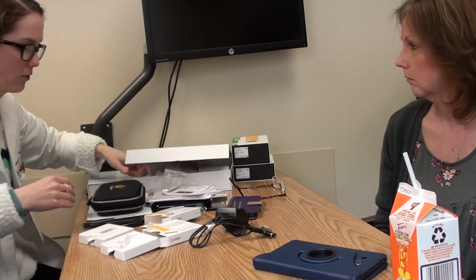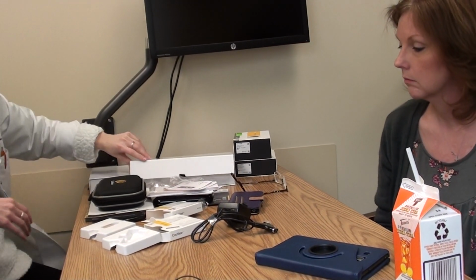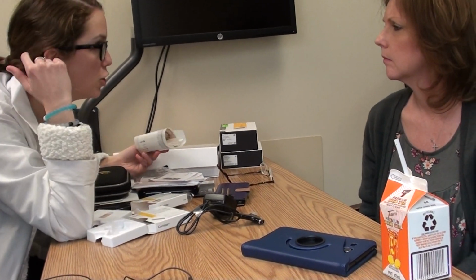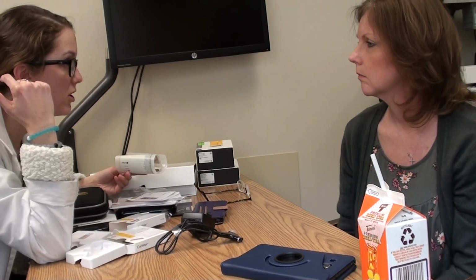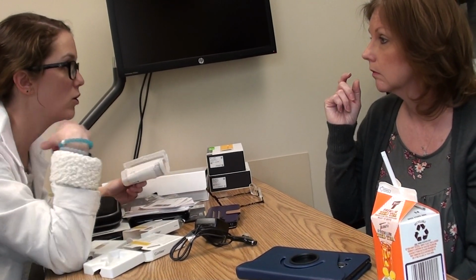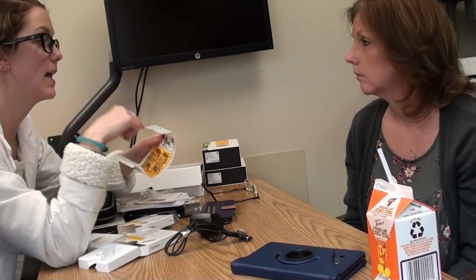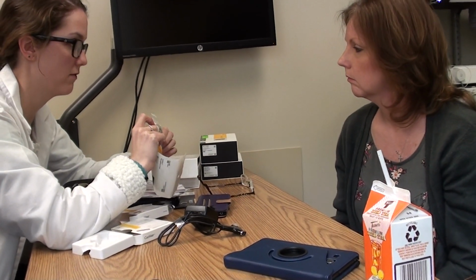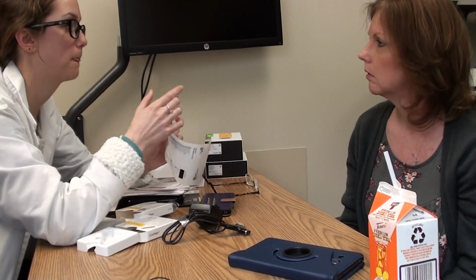I'm gonna go through mic covers and stuff too. Okay. On your hearing aid, you know how you have microphone covers? Yeah. You have those for the implant as well. So these are your microphone covers. I'll show you. Take it off for me.